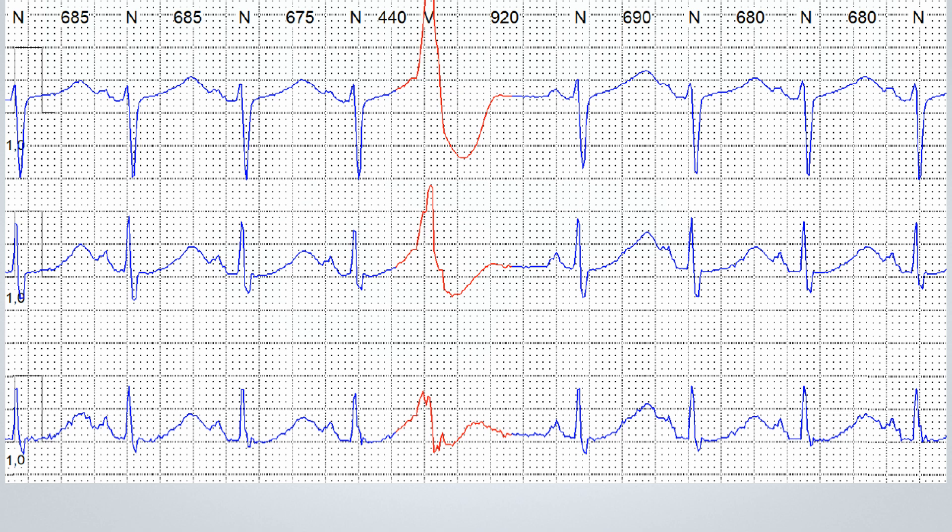Notice how the QTc interval is extremely prolonged, making it easier for ventricular arrhythmias to occur and posing a high risk of torsades de pointes. If we were not familiar with the clinical case, we might consider a diagnosis of congenital long QT syndrome.